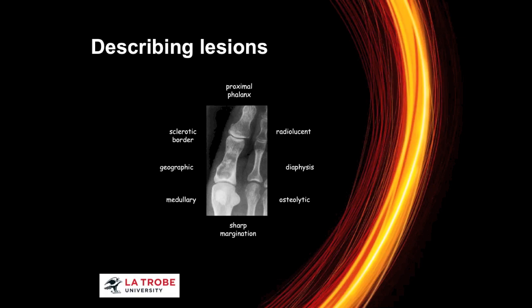They may not know the diagnosis, but they should be able to picture exactly what you're talking about. So that's the exact location, the exact appearance, and the exact radiographic terms, or using the most appropriate radiographic terms. So that's what we're endeavouring to do. There's some very simple rules to be able to achieve that, and we'll now start going through those.